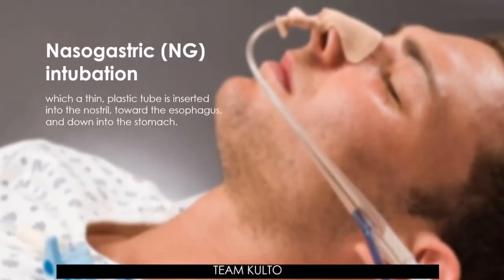All right, so let's define nasogastric intubation. Now, this is a procedure in which a thin plastic tube is inserted into a nostril or into the nose trail toward the esophagus and down into the stomach. Once an NG tube is properly placed and secured, healthcare providers such as the nurses can deliver food and medicine directly to the stomach or obtain substances from it.